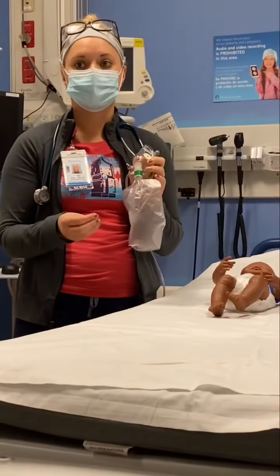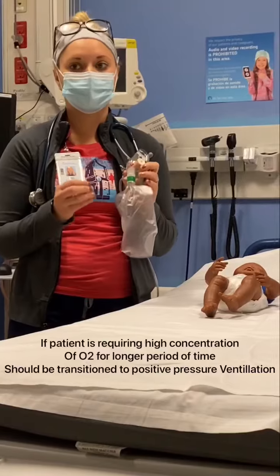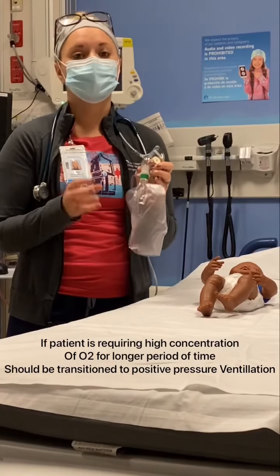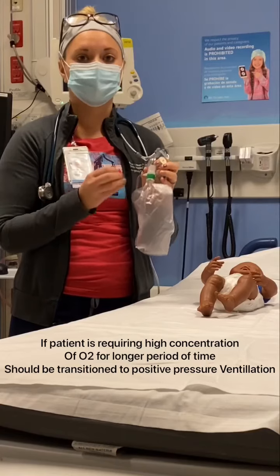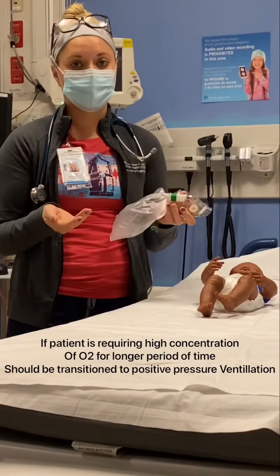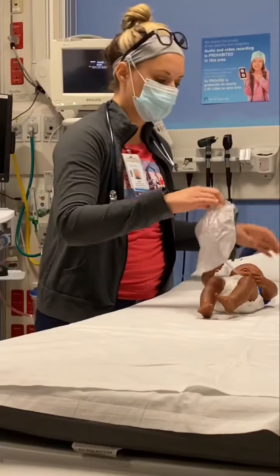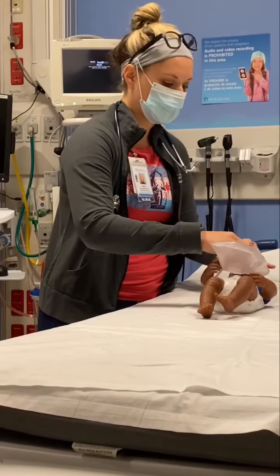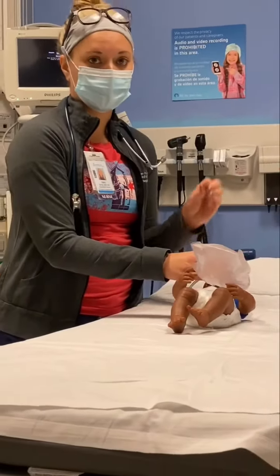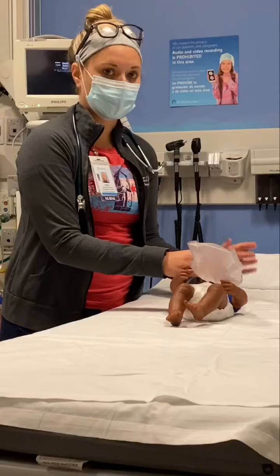Patients who are anticipated to require a high concentration of oxygen for longer periods of time should be transitioned to positive pressure ventilation, such as CPAP or BiPAP. You also want to make sure that you have a tight seal over the patient's face, as well as an appropriate size mask for the patient.